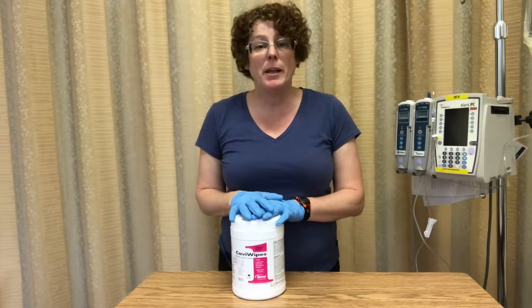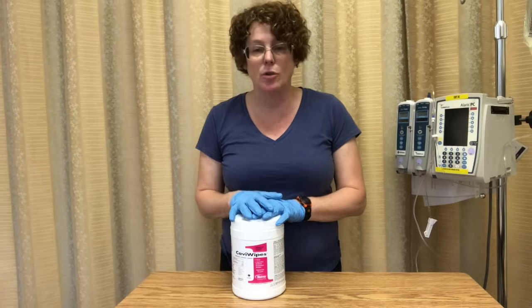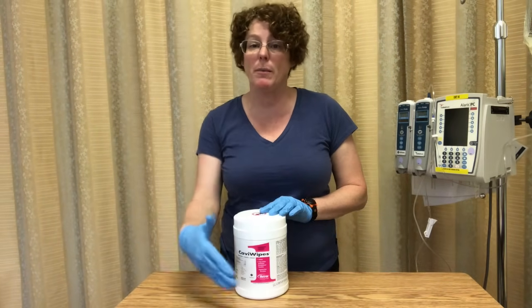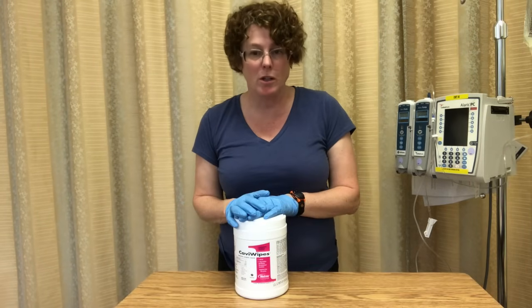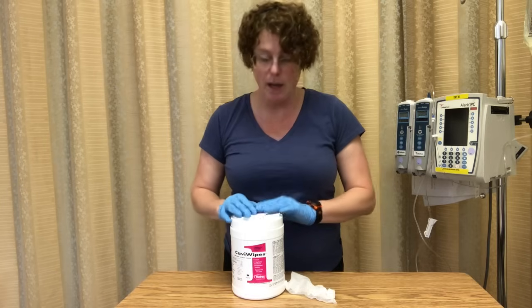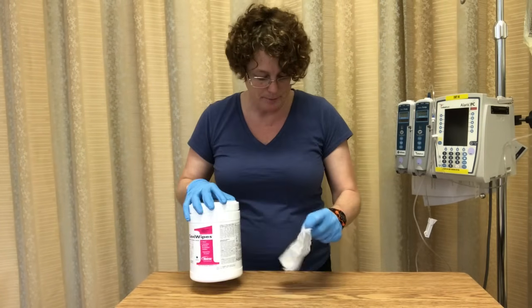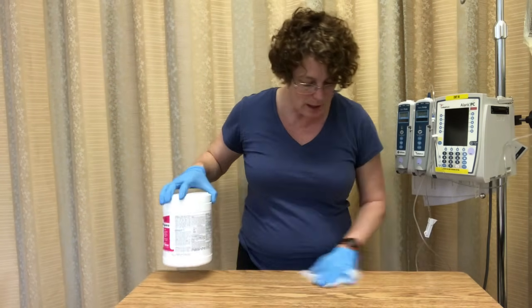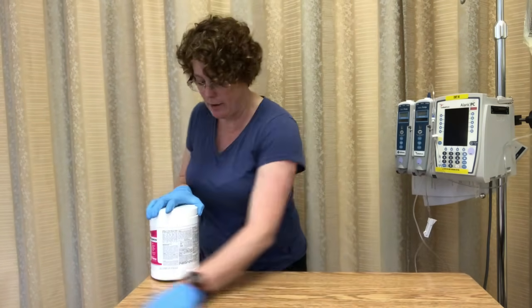We're going to look at PICC dressings, and the first thing we need to do is make sure our surface is clean. We need to cavi-wipe the table that we're going to be putting our supplies on. Always wear gloves with the cavi-wipe because they are toxic. Remove all your patient's belongings to their bedside table, give it a good clean, and let it dry.